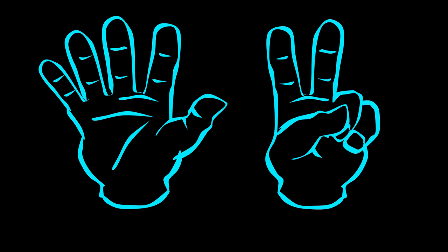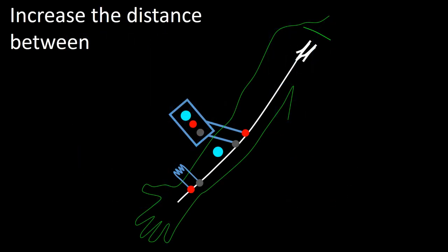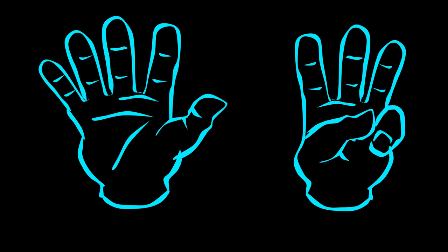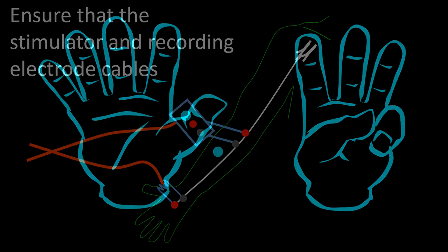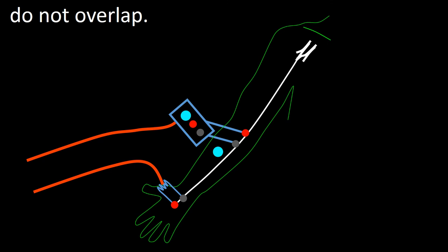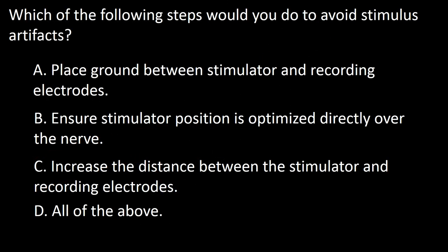Seventh, increase the distance between the stimulator and the recording electrodes. And eighth, ensure that the cables are uncrossed. So the answer to this question is D.